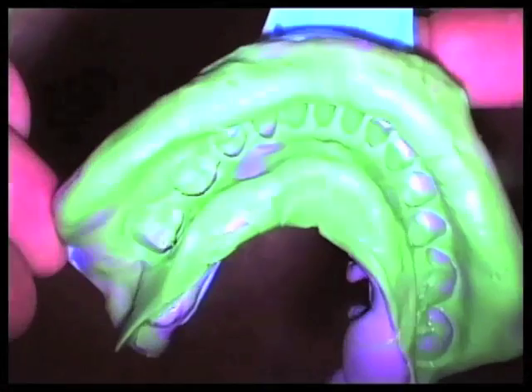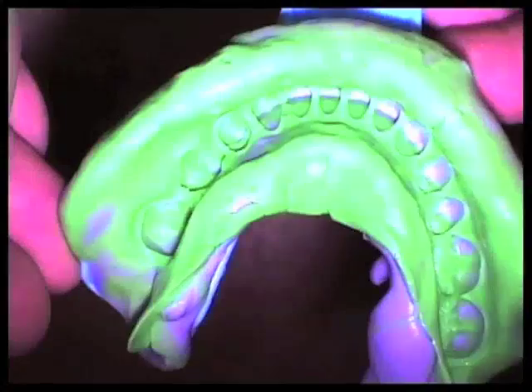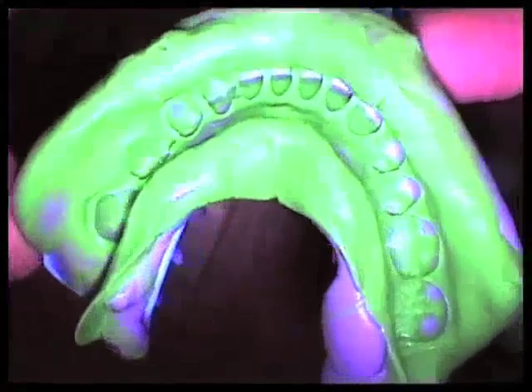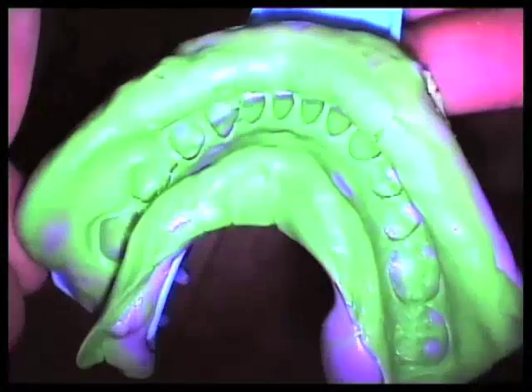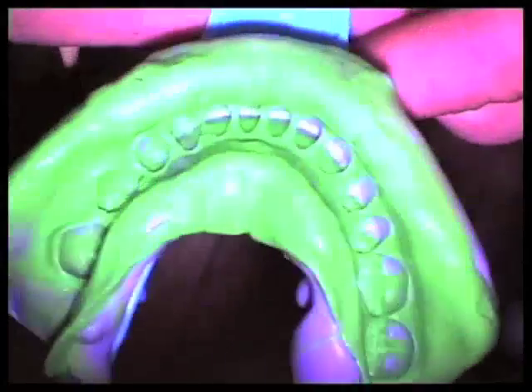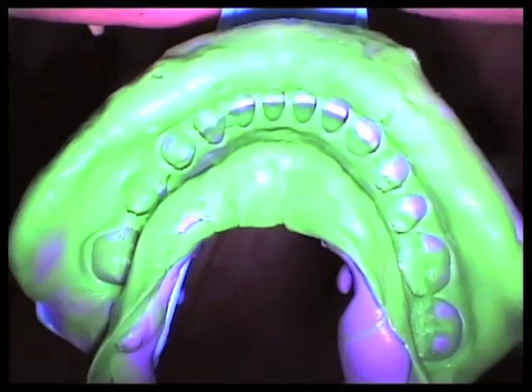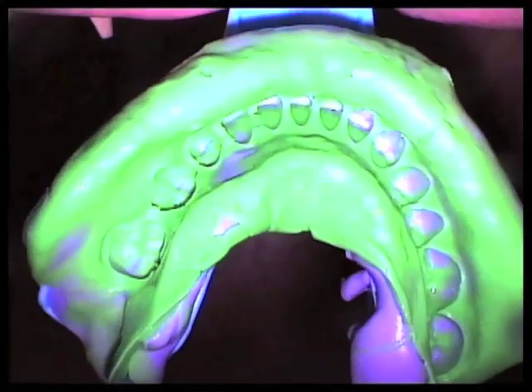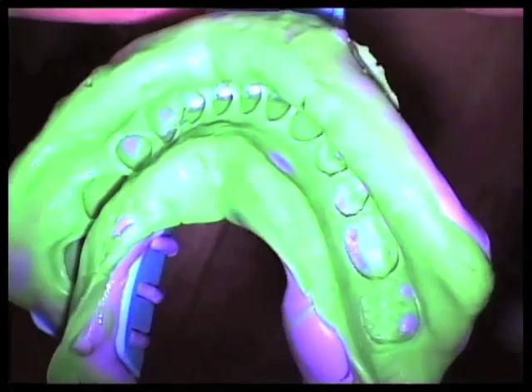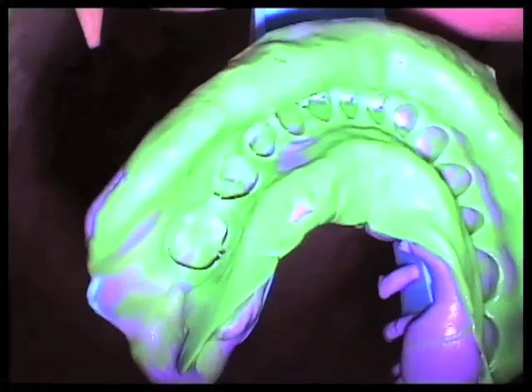So if we can do this day in and day out on our diagnostic impressions, we're going to have really good casts for a quality occlusal analysis. We'll have really good casts for opposing impressions, and this will go well with a practice that's trying to achieve optimum quality, predictability, efficiency, and increased profitability.